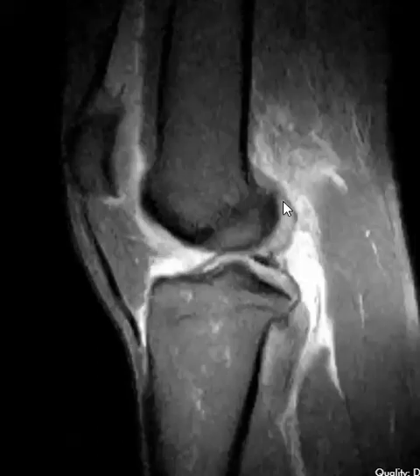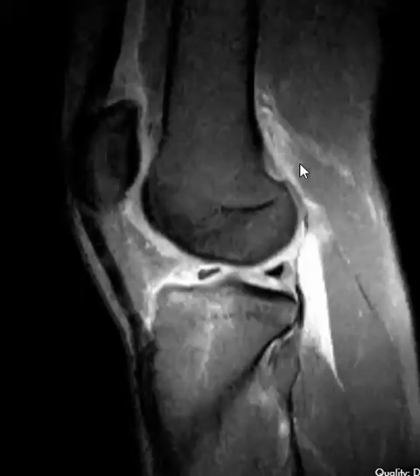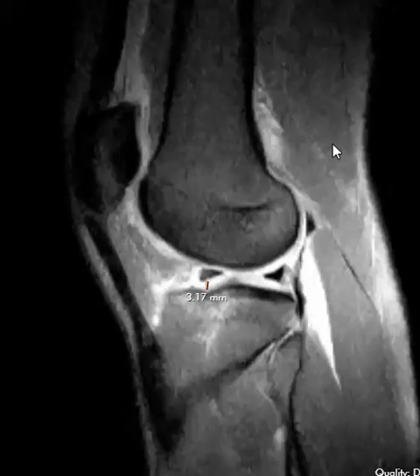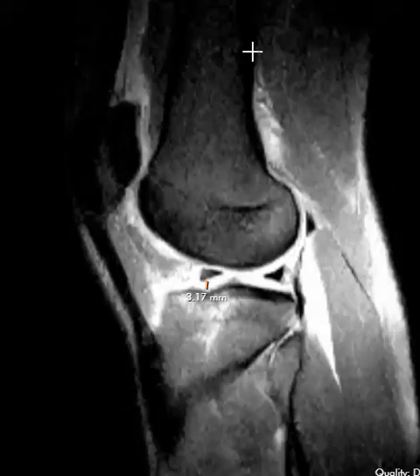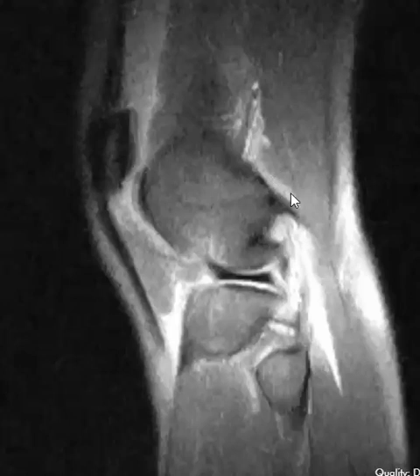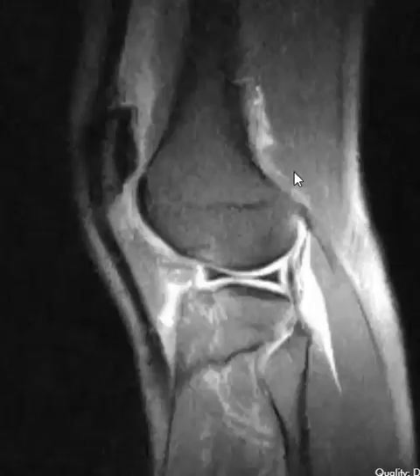Now we're going to go lateral. We're going to look for that lateral gastrocnemius tendon origin. They can be hard to see, but here it is coming up. We're just going to try to follow it to bone — it's getting close to bone. Here's a little gap here. Still that fluid-filled gap. It should be attaching to the periosteum right here, but we don't see it. Instead we see this little fluid cleft. So this is a torn and stripped lateral gastrocnemius tendon tear.